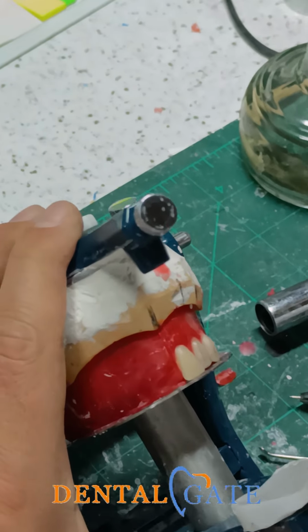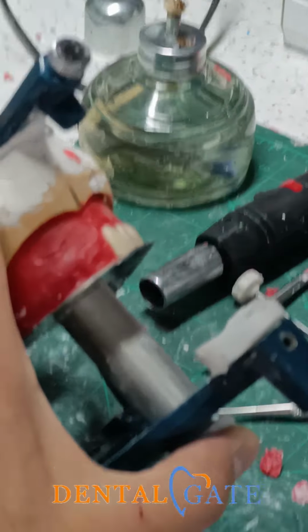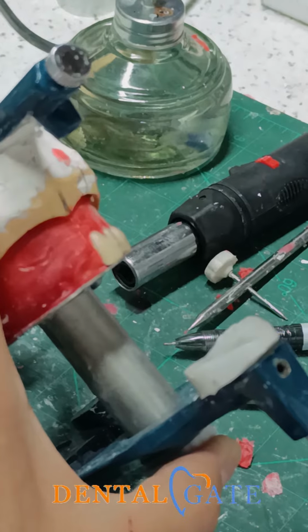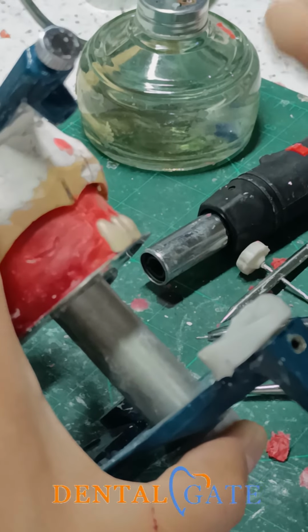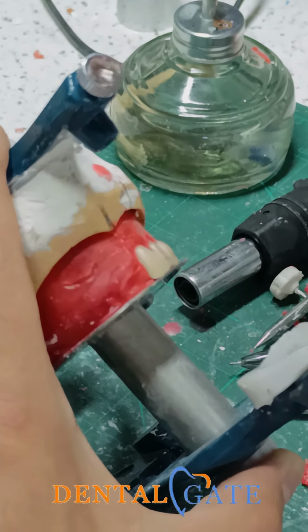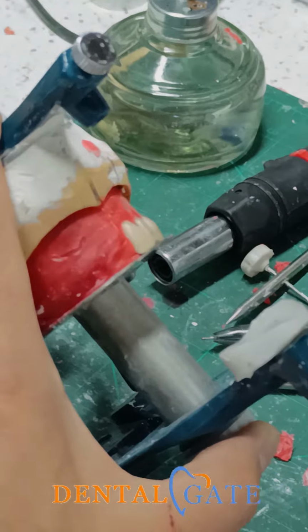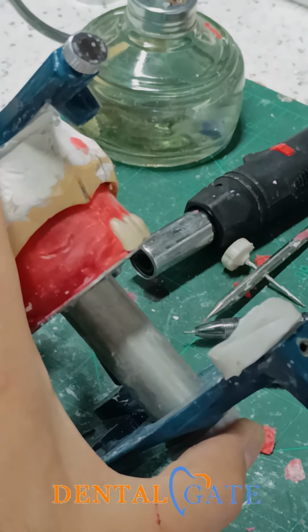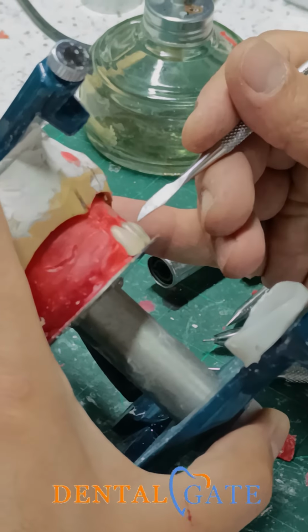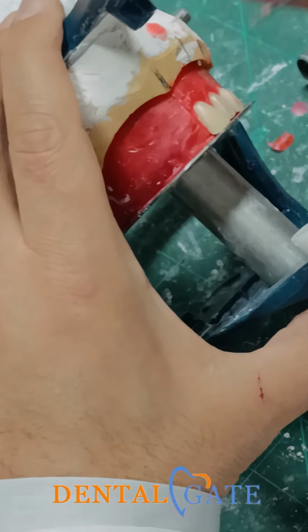So the shape of the canine will provide 3 criteria without any movement. Just put it in the proper position. The shape of the canine, not your movement, will produce 3 criteria. There is a natural inclination to the distal because of the shape of the canine. If you put it in the natural position, okay? Don't make the inclination by yourself. Just put it in the proper position. It should provide inclination to the distal. This is one. This aspect should only be seen in the labial aspect. Okay?